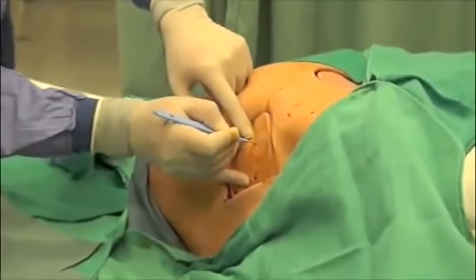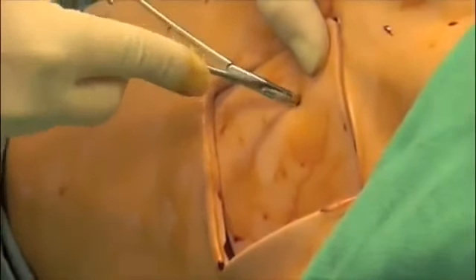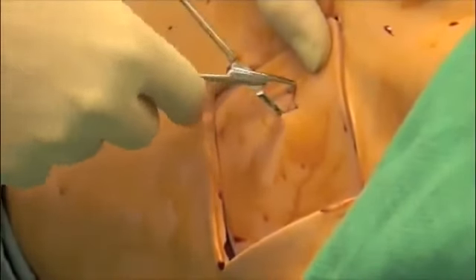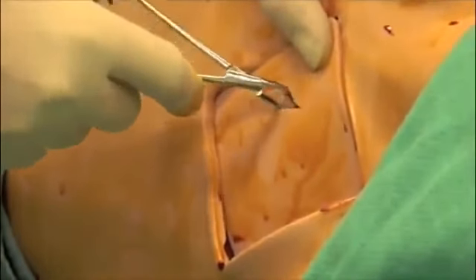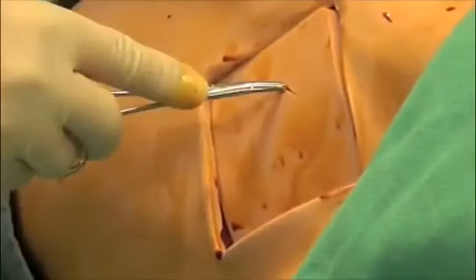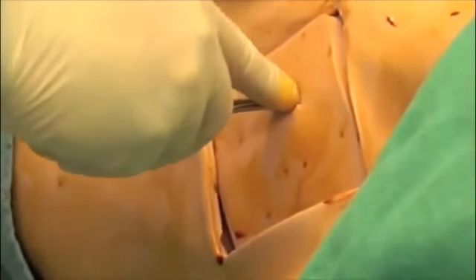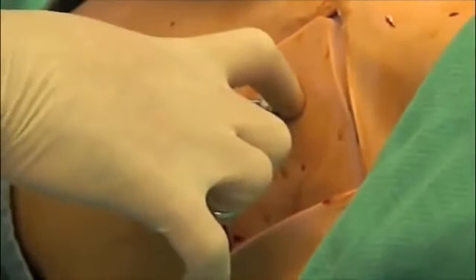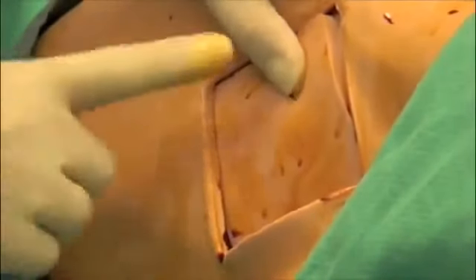Using a scalpel, make a 2 to 4 centimeter incision following the orientation of the ribs. Using curved forceps, bluntly dissect through the subcutaneous tissue just over the superior border of the rib. Puncture the parietal pleura with the tip of the forceps. This should release a rush of air or fluid. While still within the pleural cavity, spread the forceps widely, then remove.